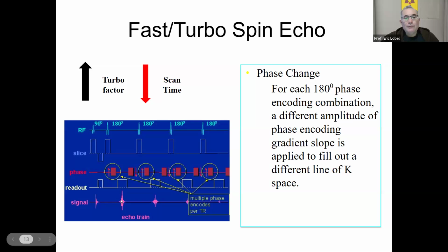Here is our echo for our first 180. Look at the signal for the second one, and then the third one. And then if you look really, really close, you could see that teeny weeny baby one over here. That is the trade-off, okay? That's the MXY curve. Here, you're showing it where the signal is definitely going down.